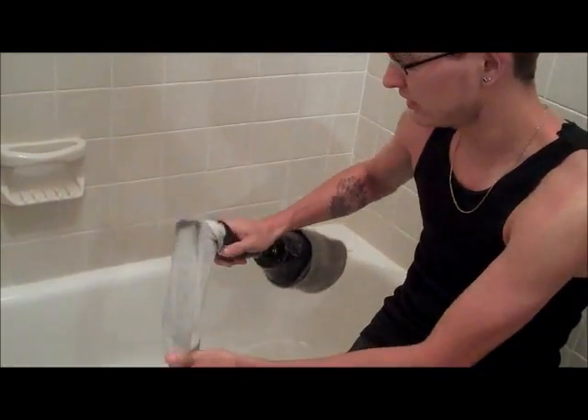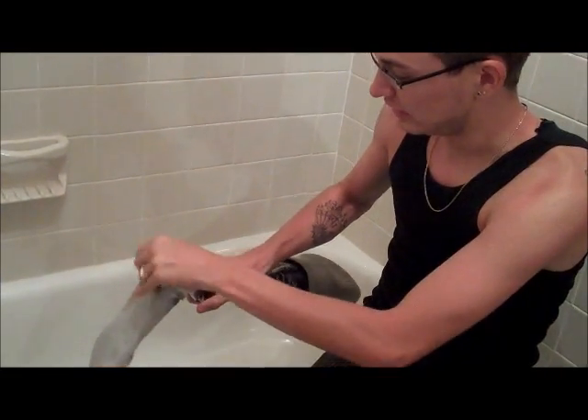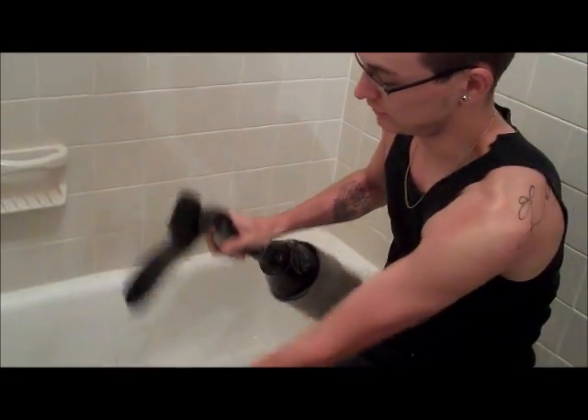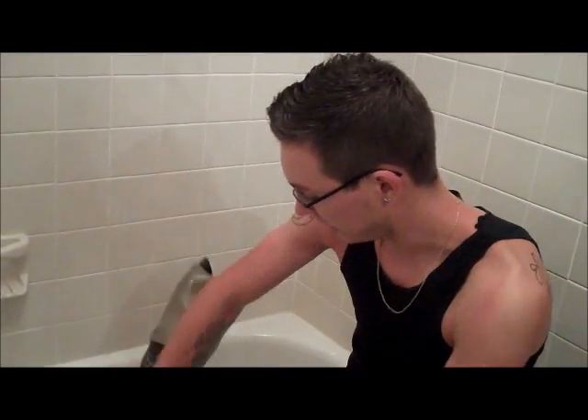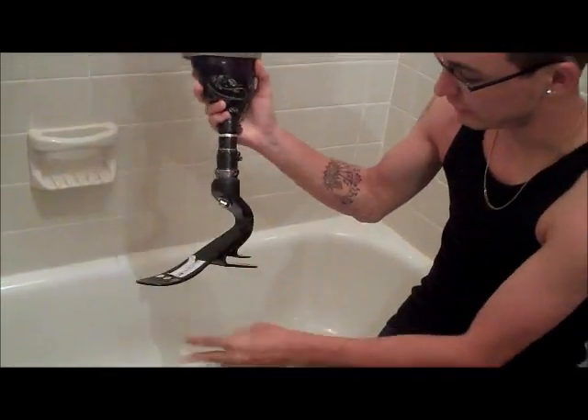Then you have probably a Spectra sock. Not everybody uses these, but if you do use a Spectra sock, it's going to be just wet and gross. So go ahead and take that off and get it out. This is the bare foot.